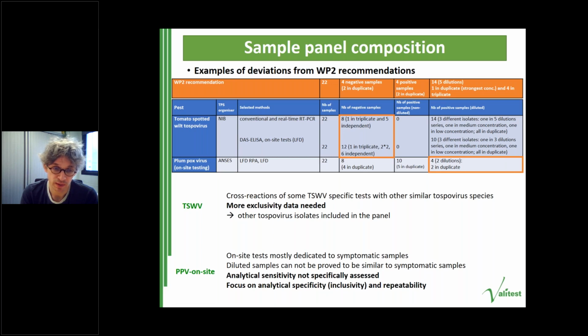However, we can't tell if diluted samples are similar in terms of concentration to symptomatic samples. And it's the reason why the analytical sensitivity was not specifically assessed. The organizers decided to focus on the analytical specificity and on the inclusivity especially, but also on the repeatability.